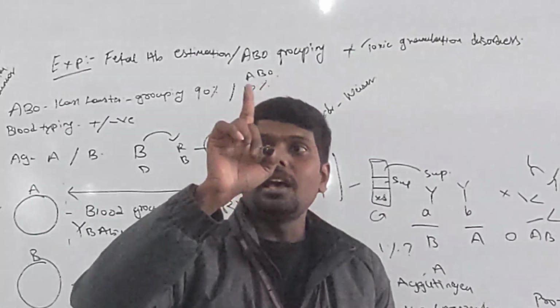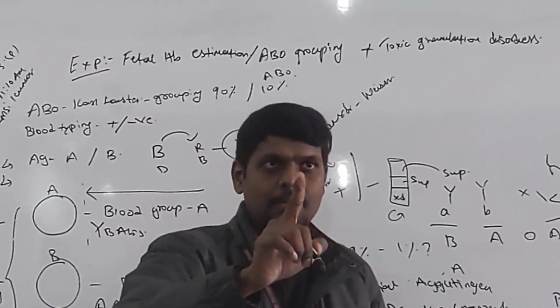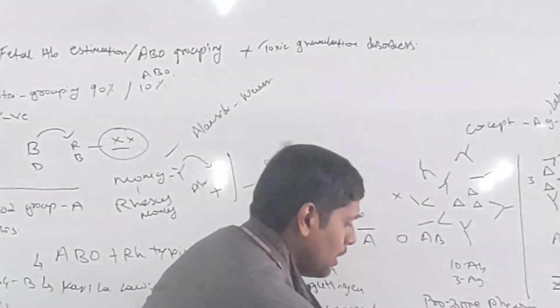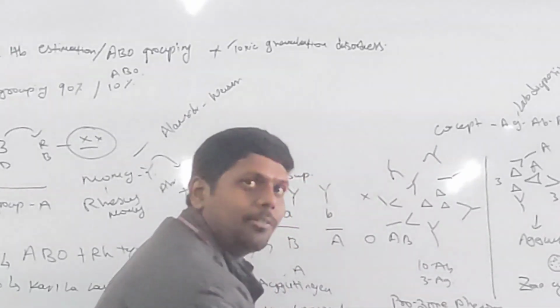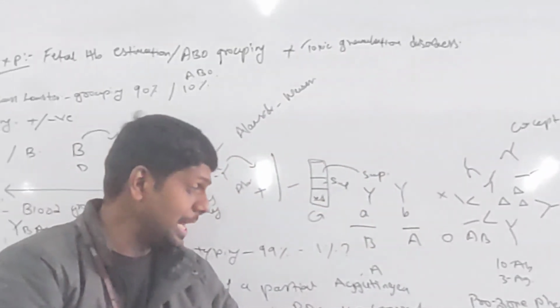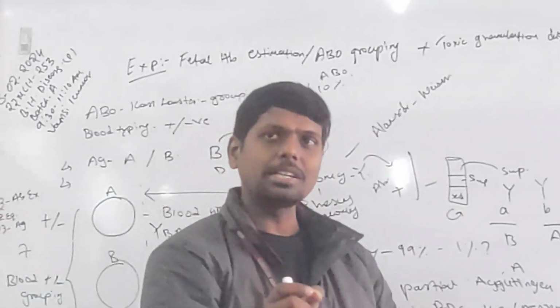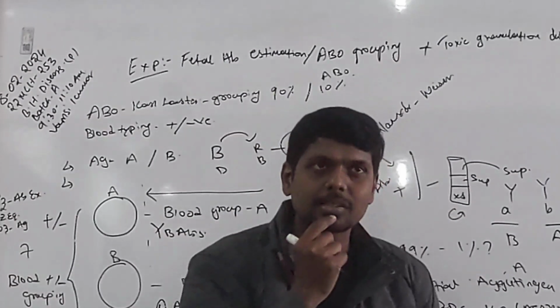contamination can cause erroneous results. That I will take. But I was stating about the false negative results. Any more factors leading to false negative results?